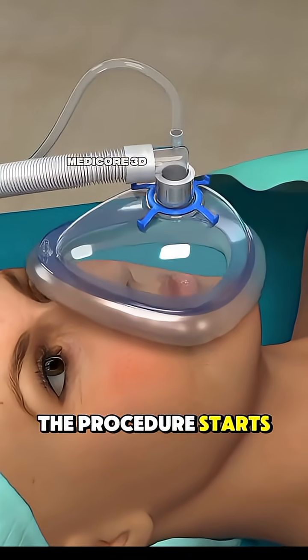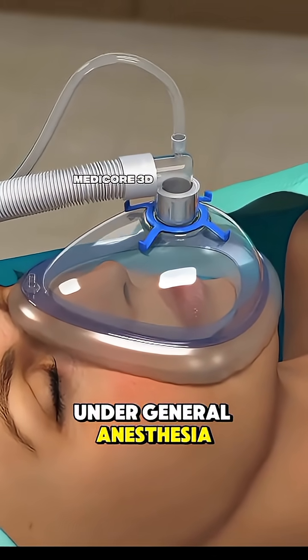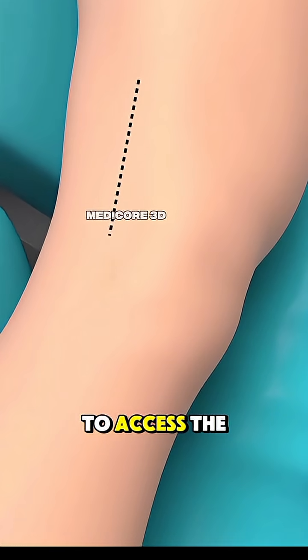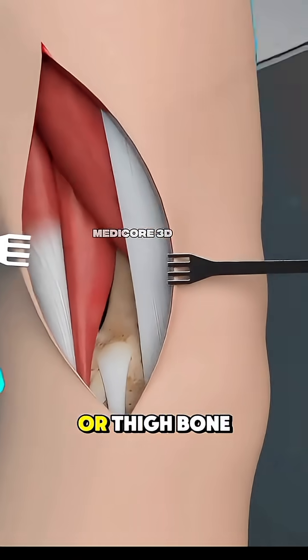The procedure starts with the patient under general anesthesia. The surgeon makes an incision just above the knee to access the lower part of the femur, or thigh bone.